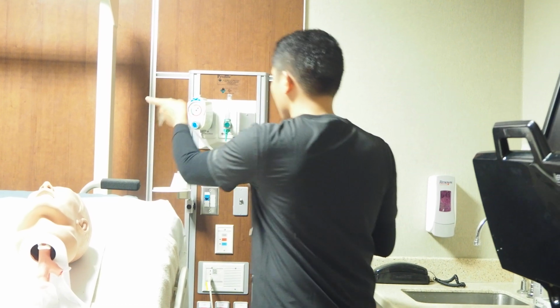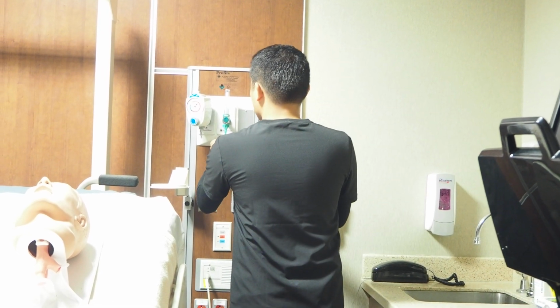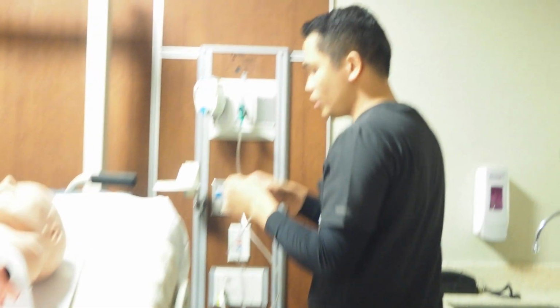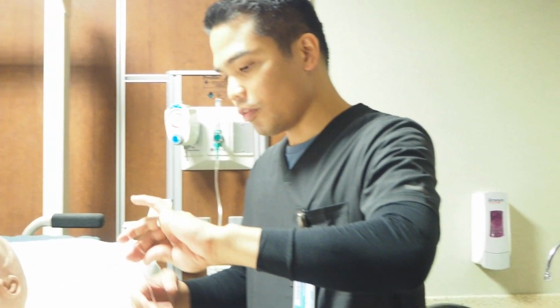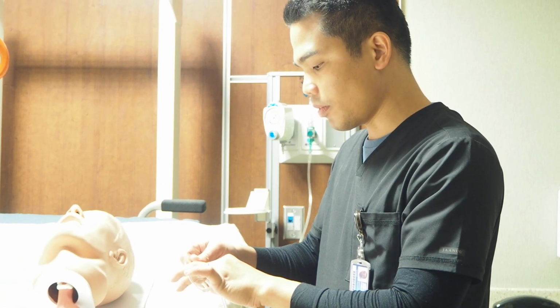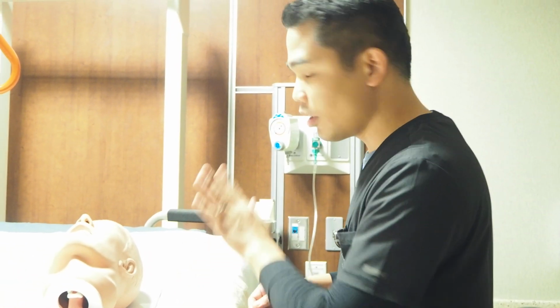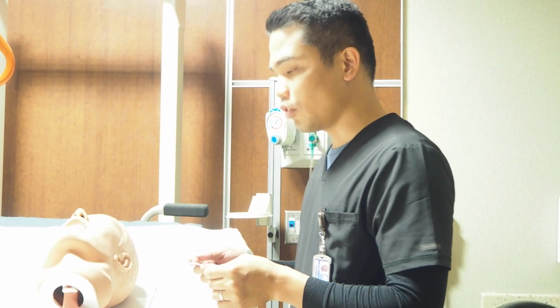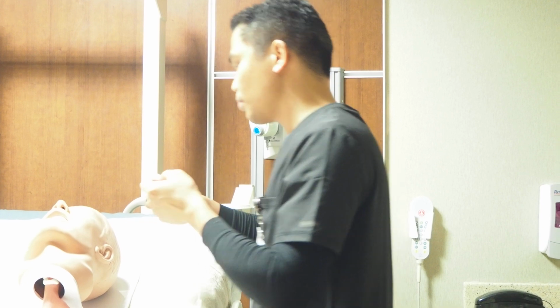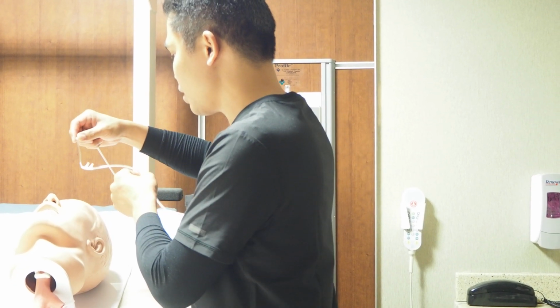So I have here the nasal cannula. I'm going to set the flow at 3 liters, and before putting it on the patient, I'm going to feel the flow. There's air coming out from the device. And even though the patient is lethargic or not too responsive, we still explain it to the patient. So Mr. Smith, I'm here putting on a nasal cannula.